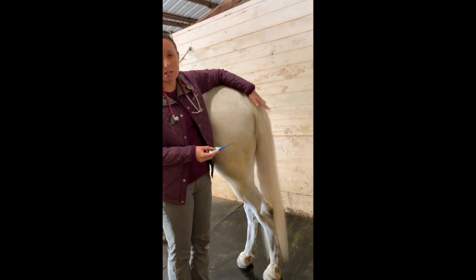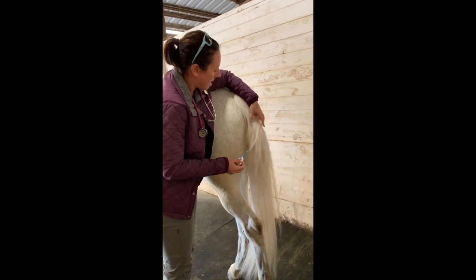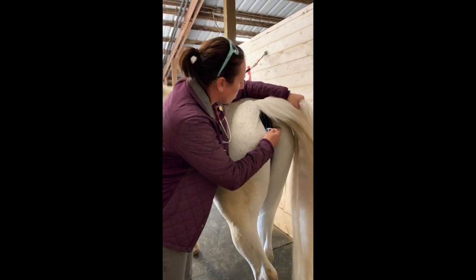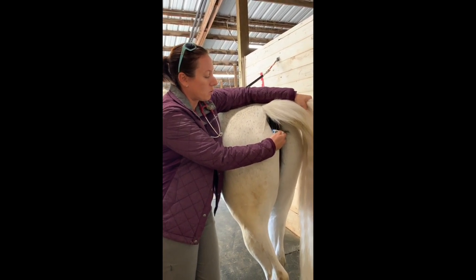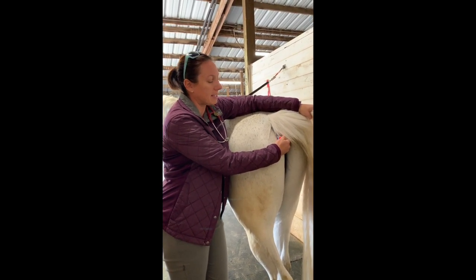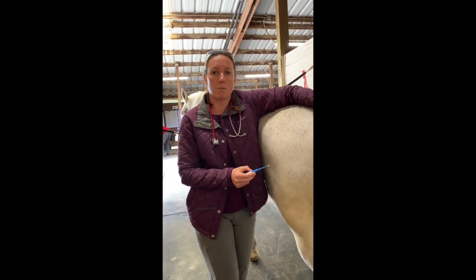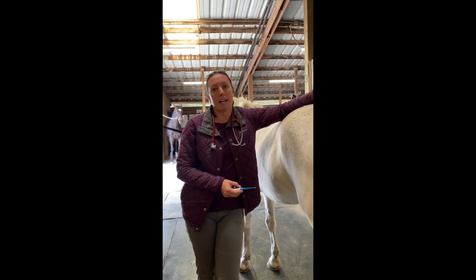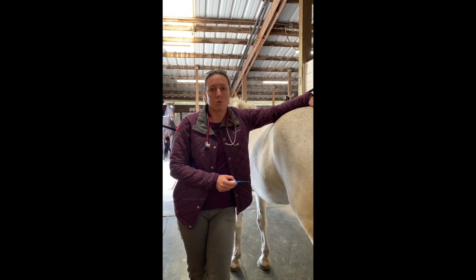You stand on the side of your horse, move their tail over, and when you insert the thermometer, make sure you are holding it against the side of the body wall. This is important because it is actually possible to take a temperature of manure if you stick it right in the middle. Hold it against the side of the body until it beeps. Normal is 99.5 to 101.5, and just like heart rate, every horse has its own normal, so get used to taking that and you'll know where your horse usually sits.